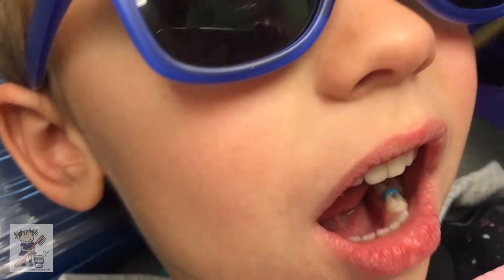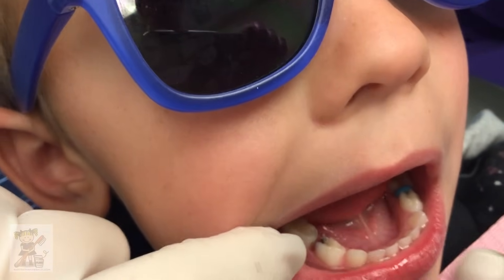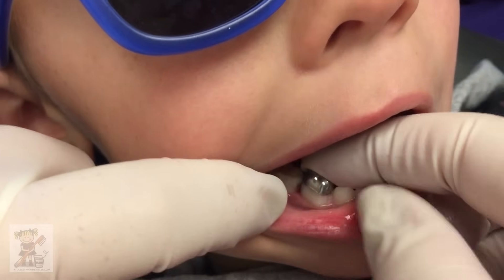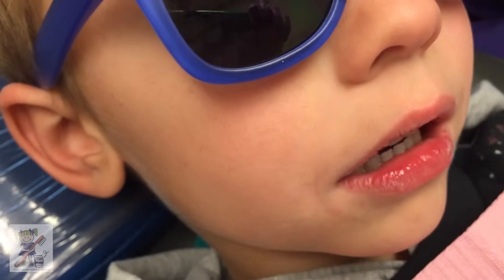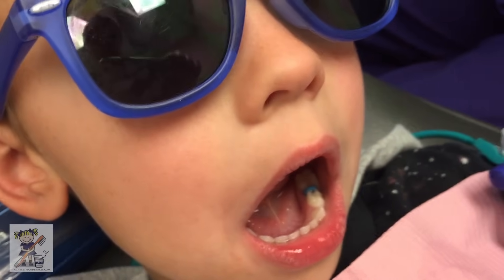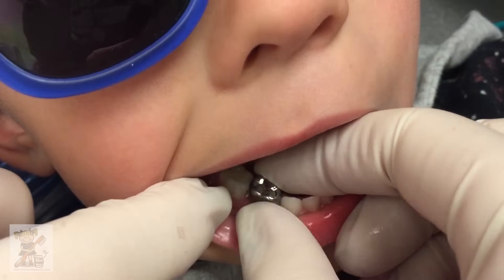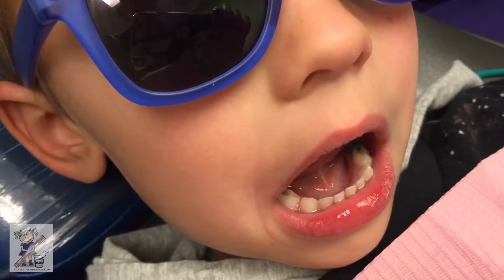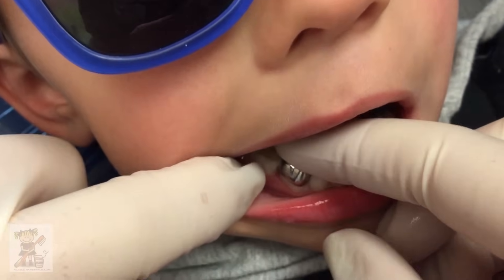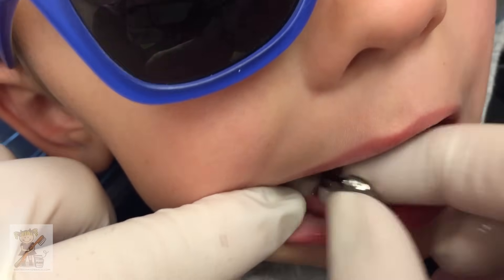All right, and then we're going to use the new Smile stainless steel crown. I can basically eyeball these now, but this is a size four — that is not big enough to go down, obviously too small. And then this is a size six — obviously too big. So it's the one in between, the size five. That's the one that's going to be just right. You just want to visualize it going down over that mesial buccal bulge.